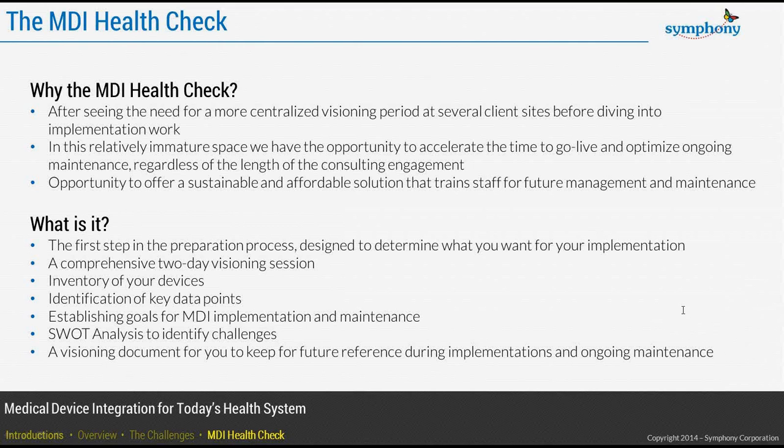Rarely do we run across a device that's simply not supported. The one problematic device that comes to me right off the top of my head is that the IV pump manufacturers have been pretty slow to provide a really good, reliable data output that is usable for real-time data.